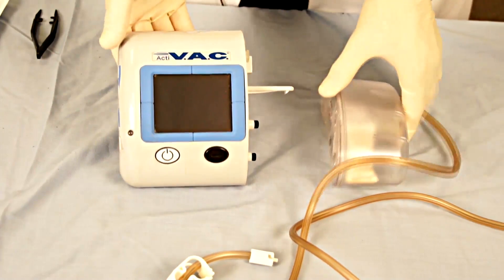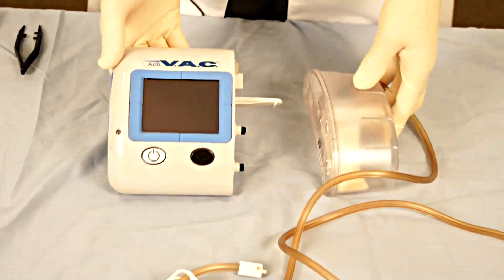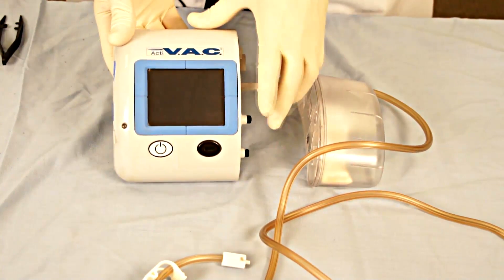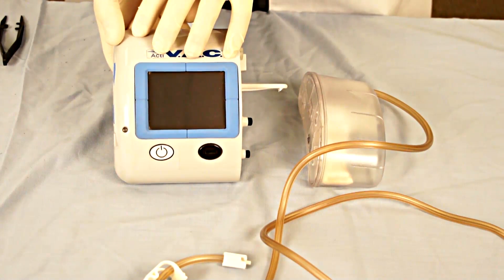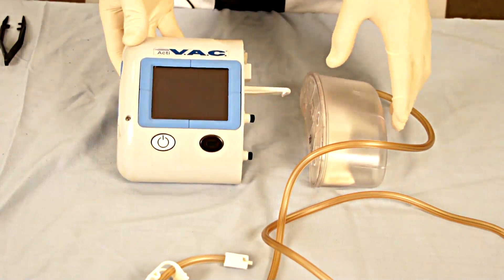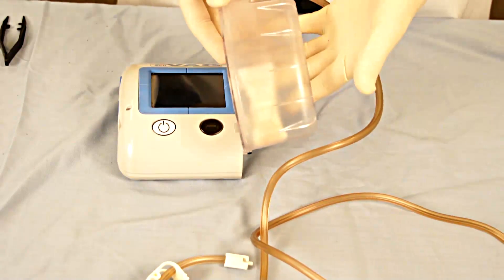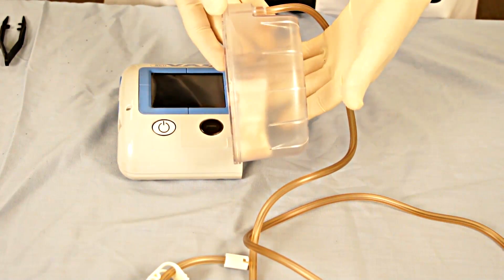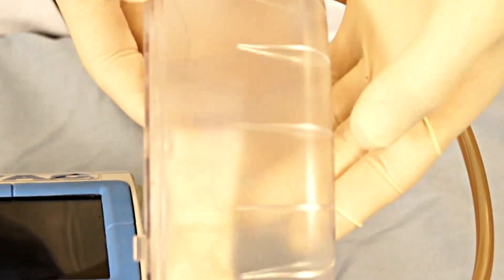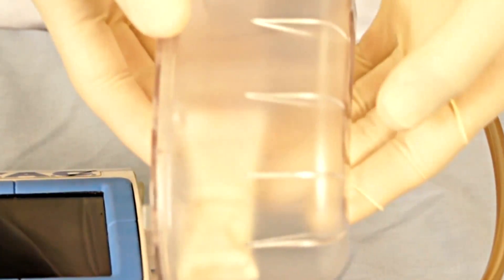This device has two components to it. One is the permanent device itself that has the generator that creates the suction or the negative pressure. There is then a disposable component which is the canister that will collect the drainage from the wound, including the edema fluid as well as exudate and other fluids that are removed from the wound.